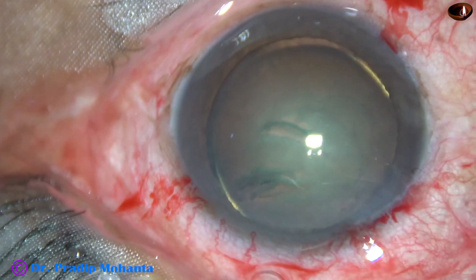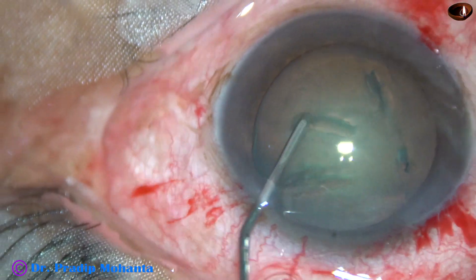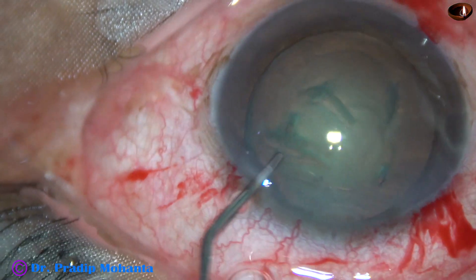Hydrodissection is done. Hydrodelineation is also attempted. And now the nucleus is mobilized.